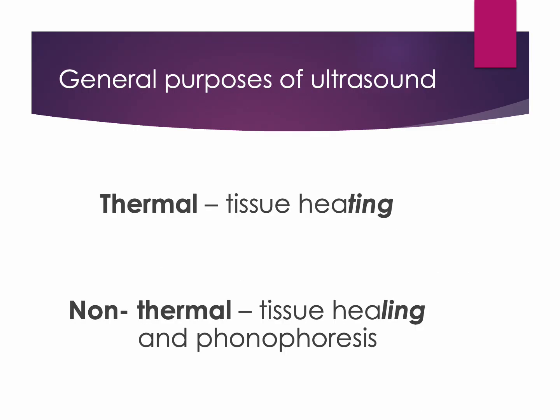Ultrasound has two primary purposes: thermal and non-thermal. Thermal effects involve tissue heating, while non-thermal effects are more related to tissue healing and processes like phonophoresis, which will be discussed later.